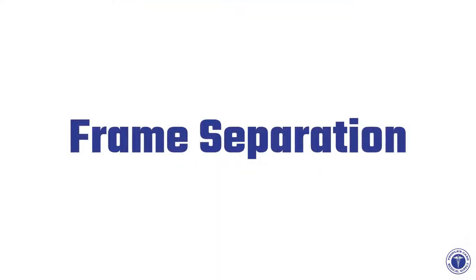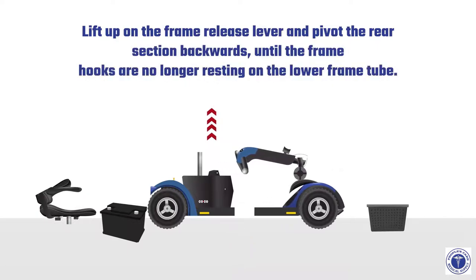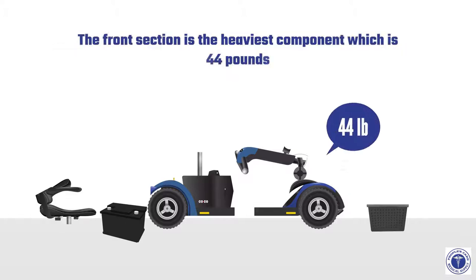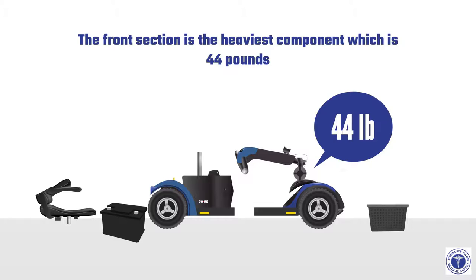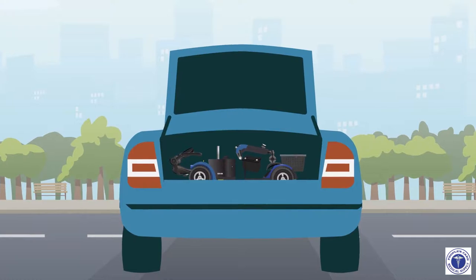For frame separation, lift up on the frame release lever and pivot the rear section backwards until the frame hooks are no longer resting on the lower frame tube. Slowly separate the two sections of the GoGo Sport Scooter. Note that the front section is the heaviest component at 44 pounds. All five pieces can safely fit in the trunk of your car.